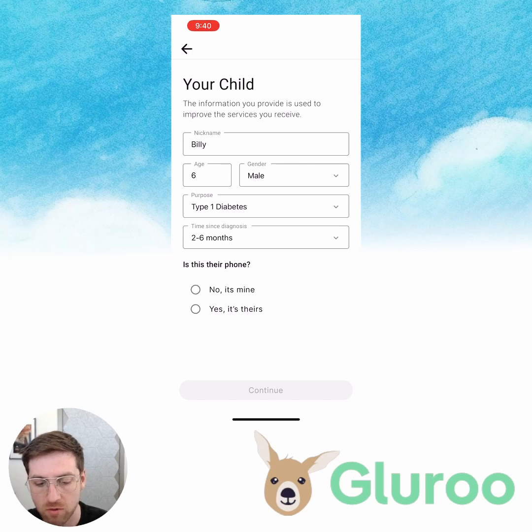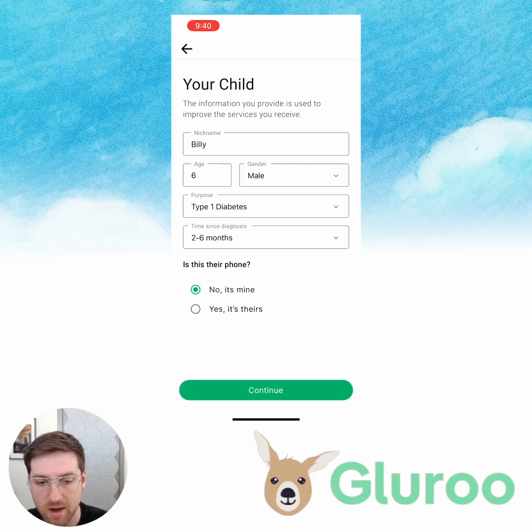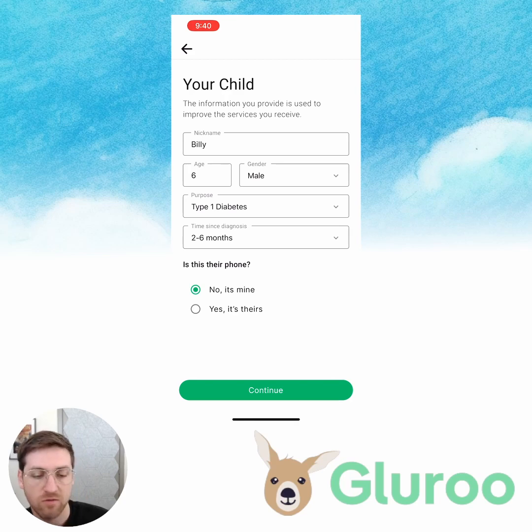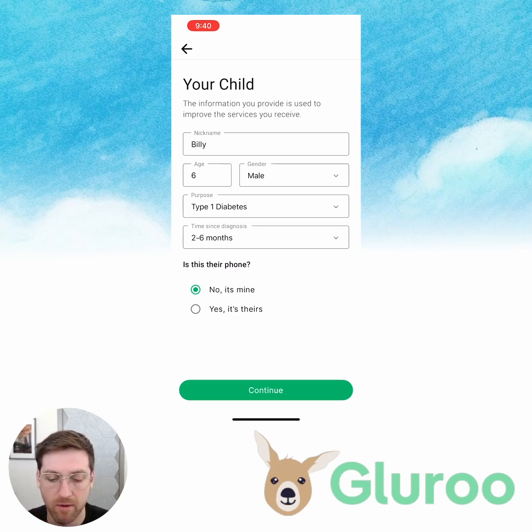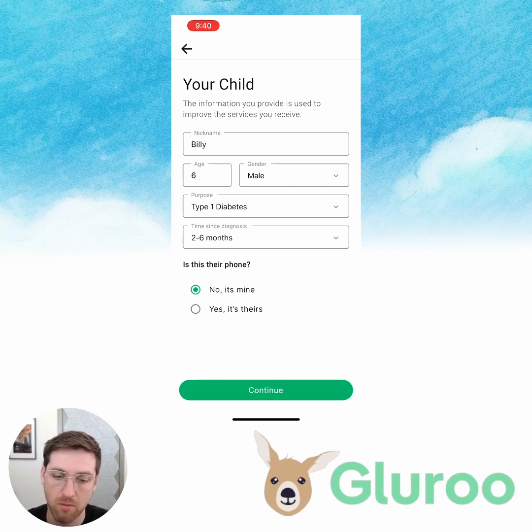Now this is an important question: is this their phone? No, this one's mine. I'm going to pull up his phone, which is the iPad that I'll be showing here in a second. But for right now, I'm saying this is my phone and then we're going to onboard him in a second.